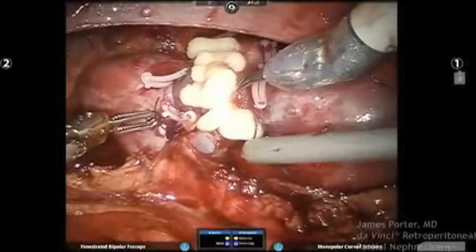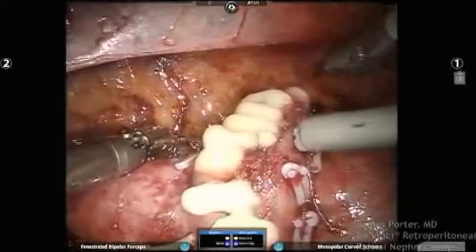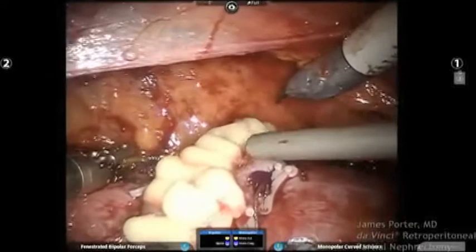I don't know. Would anybody else here consider doing a... I never have, and usually if it's large, you see it. If it's small, it's going to get closed with your deep layer. Yeah, I don't think we're in... I think your point is that it's a deep lesion. I don't think you are either. I think your point is it's a deeper section, your concern, but I think he's fine.